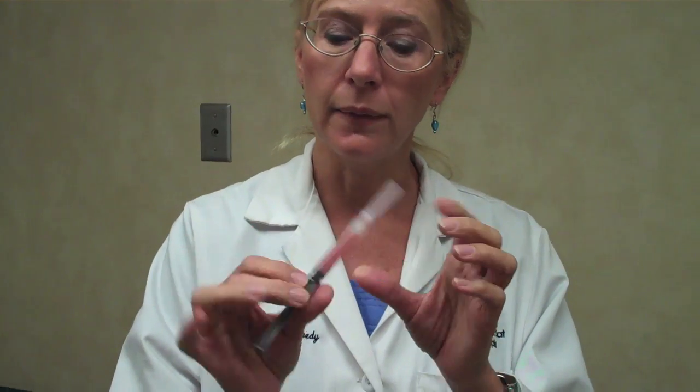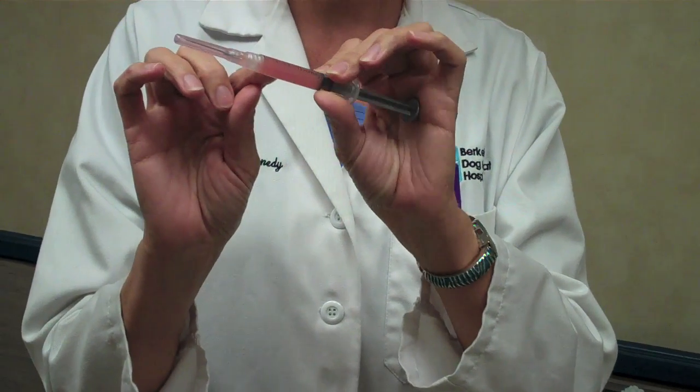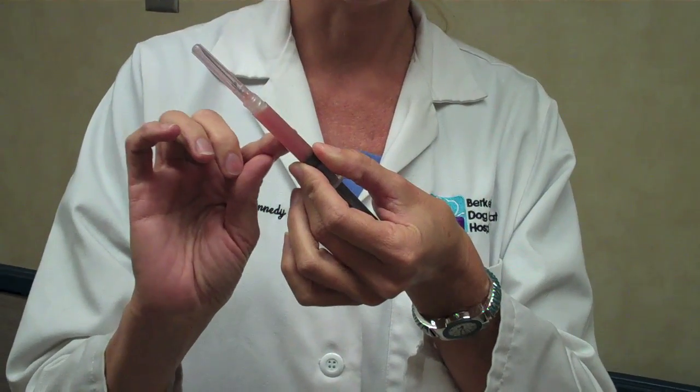Now, if we didn't do this, that lump is going to continue to get larger, and then eventually it's going to break open, make a big mess, make a big infection right there. But if we knock him out for probably 15-20 minutes, and then open that up, I can clean it and drain it. Now this is the fluid that's inside, okay? It's a type of pus. So it's fluid with a little bit of red blood cells and white blood cells in it, and this is what's going to accumulate when you have an infection.